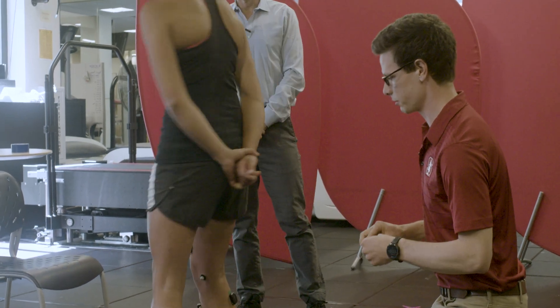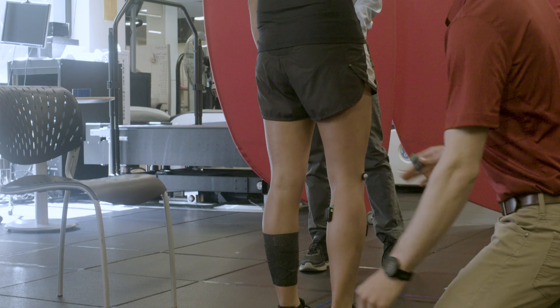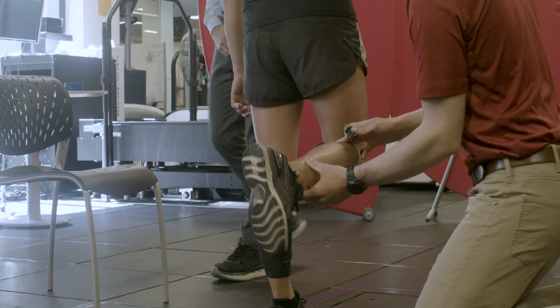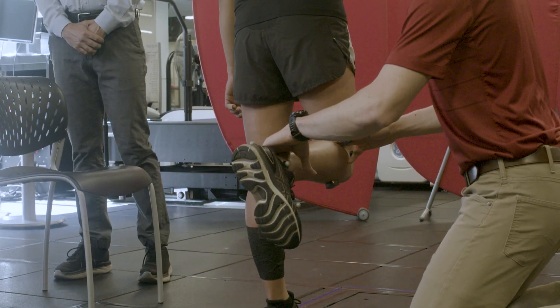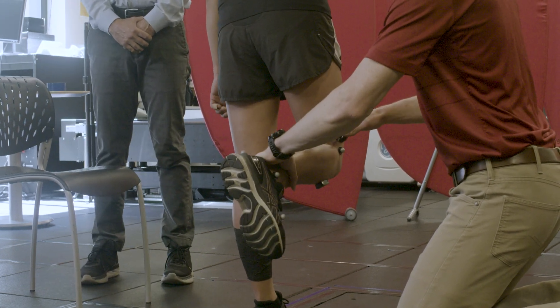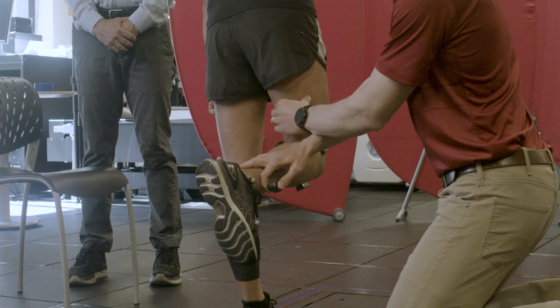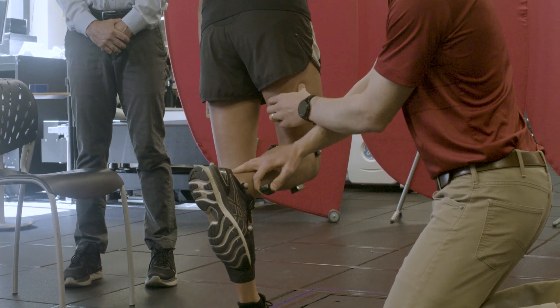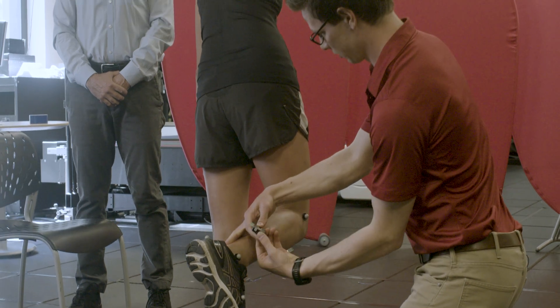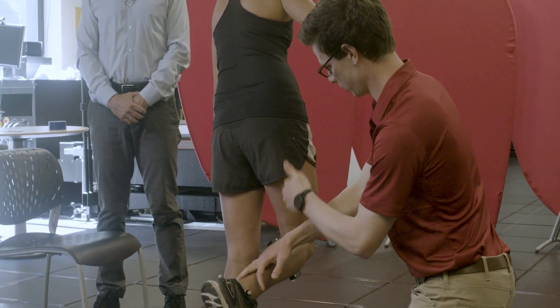Now we'll do one of her hamstring muscles — the biceps femoris long head. For this, we'd have Hannah flex her knee and push down on the back of her ankle while she resists, which will activate her hamstring. We'd find her hamstring tendons attaching into her tibia, work our way up to find the muscle belly, and the biceps femoris is on the lateral side with fibers running fairly longitudinal.